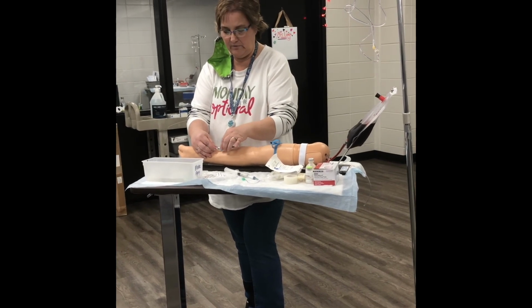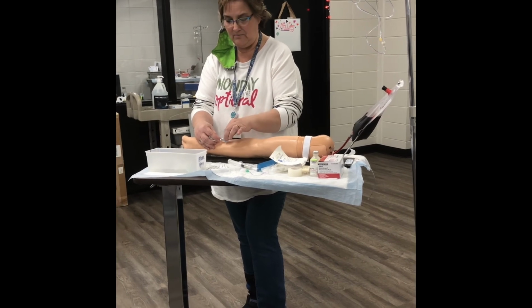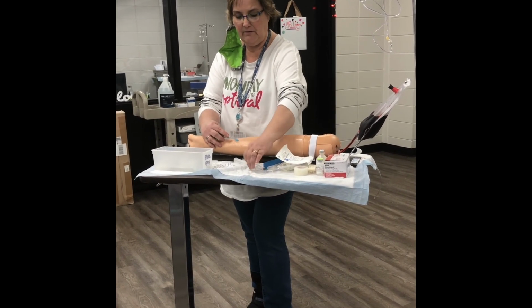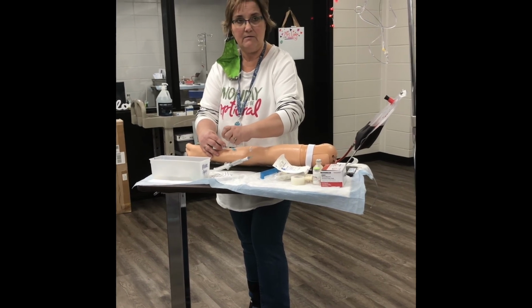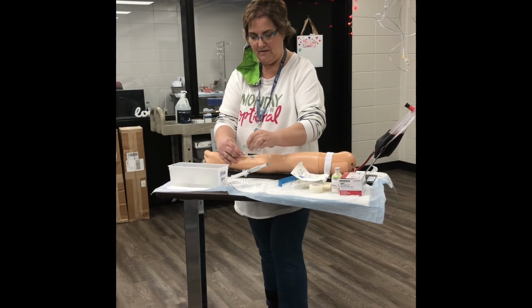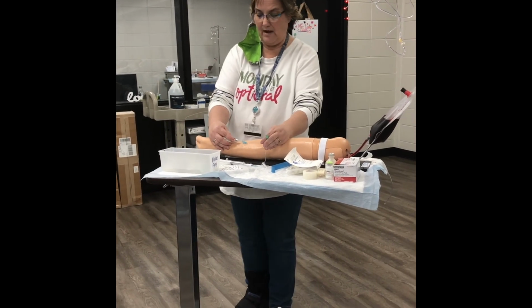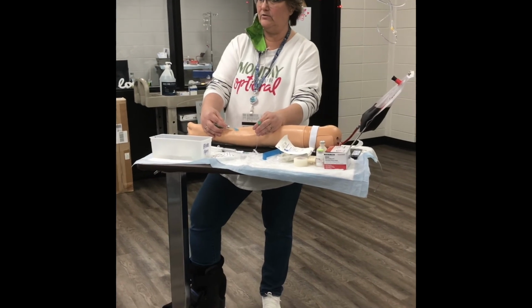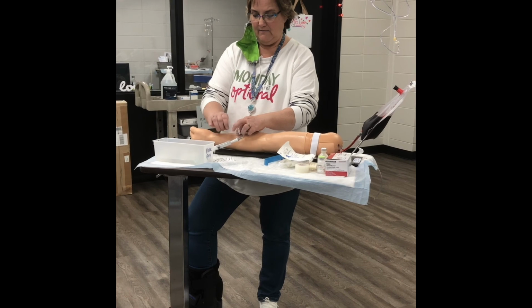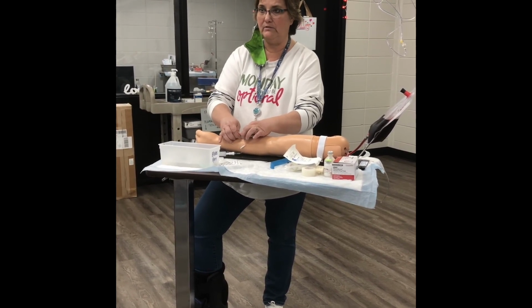All right, so I've lowered it. I'm going to go ahead and pop my tourniquet because that doesn't need to stay on. I'm going to advance this all the way to the skin. I'm going to go ahead and get this ready. Maybe. There we go. Okay. Now, even though I have let that go, this is still in there, so I'm okay, because I'm going to hold this. I'm going to pop this, flip it around. If it bleeds a little, that's okay. A real person's going to, all right?